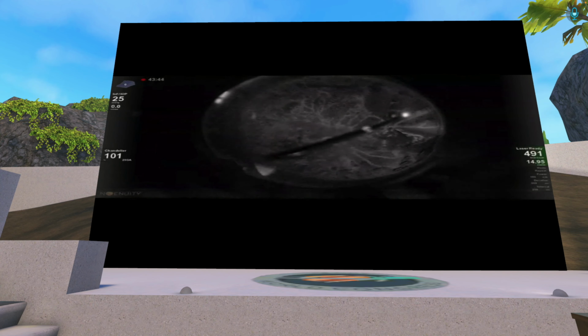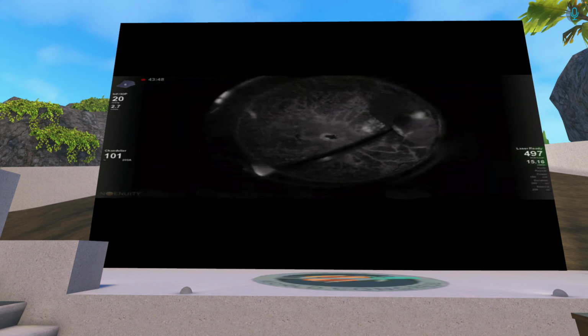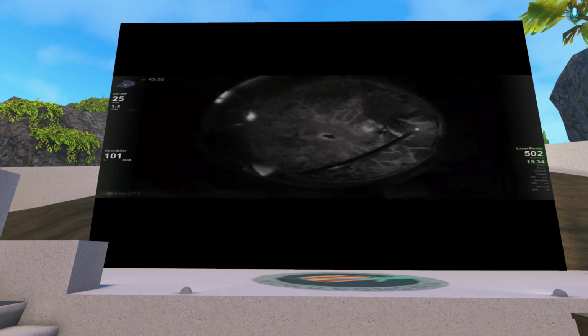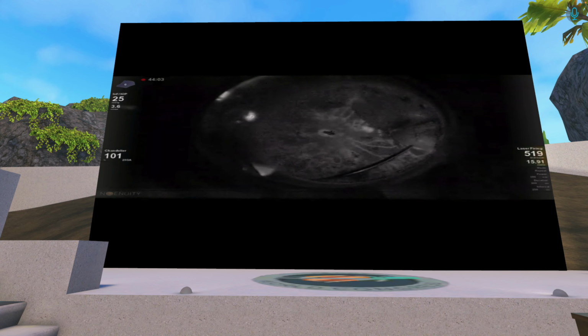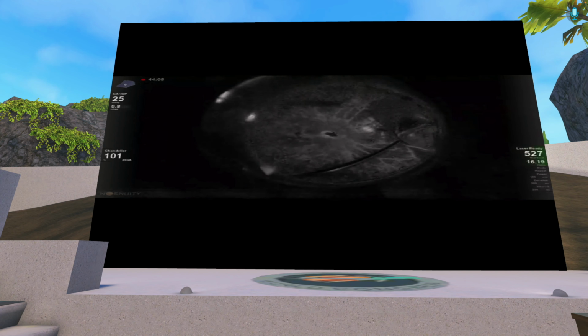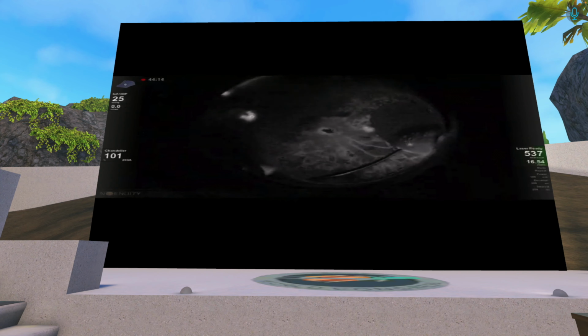So you can see how gently I can laser only the non-perfused areas in the far periphery, and I do believe that this is the right way to go, especially in order to somehow protect the eye from NVG strike, because this is the main problem of such eyes with advanced ischemia, that after the good surgery we might end up with acute neovascular glaucoma.